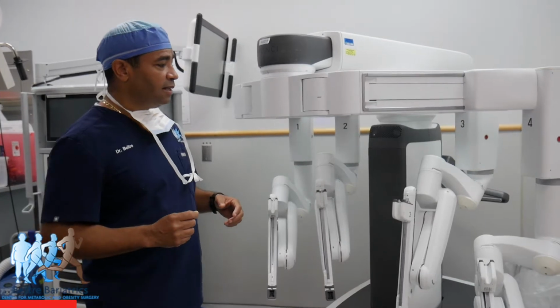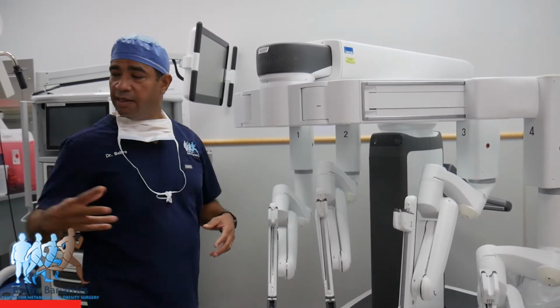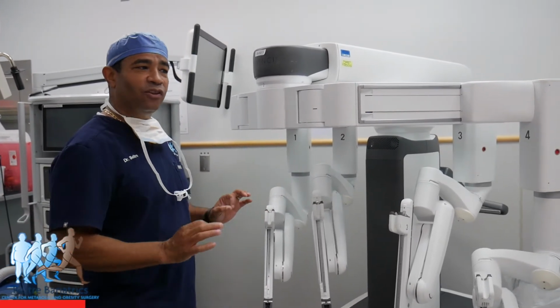I'm going to show you guys how I operate this robot remotely. So I'm going to be sitting at the console over there, controlling each and every movement of the robot. The robot doesn't have any thoughts on its own.